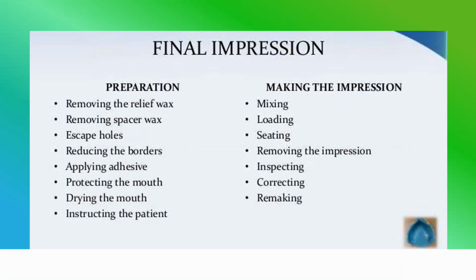So before final impression making, we ensure that we remove the relief wax and spacer wax, and ensure that the tissue stops are directly contacting the tissues, and that we do not break the border molding material.